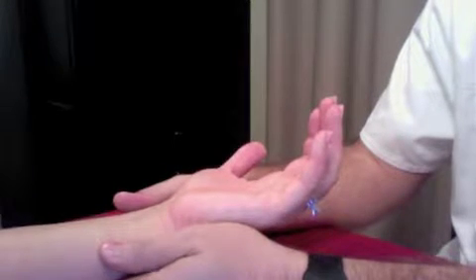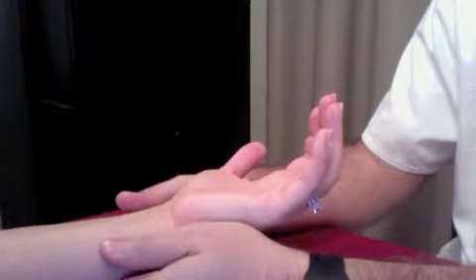If the fingers do not flush back with color within 5 to 15 seconds, the test will not be able to be completed because of insufficient blood flow.